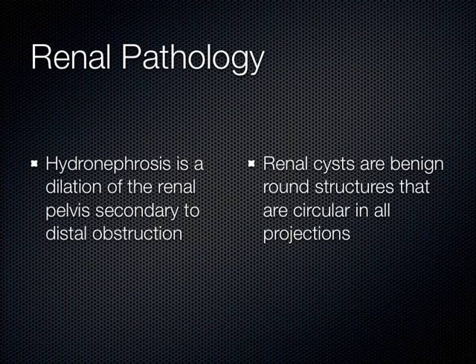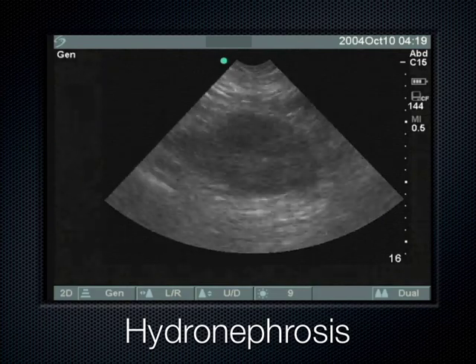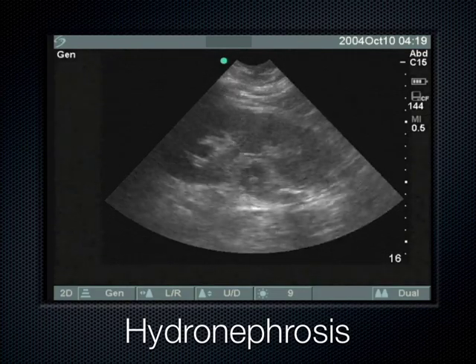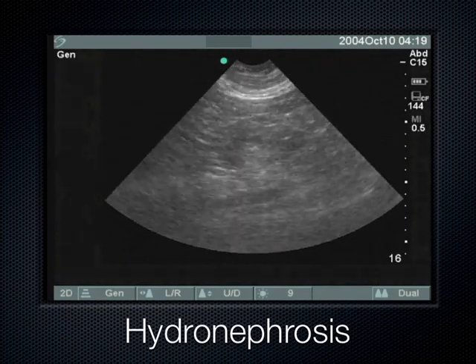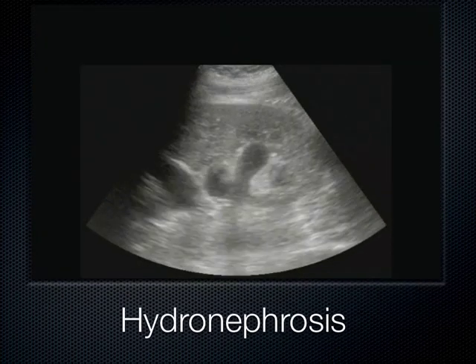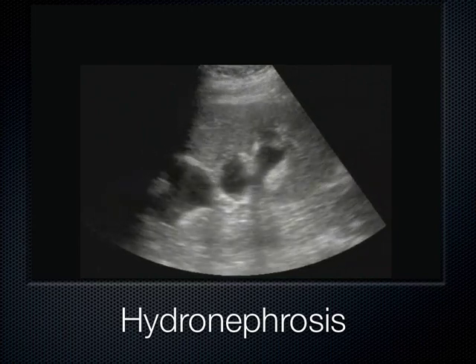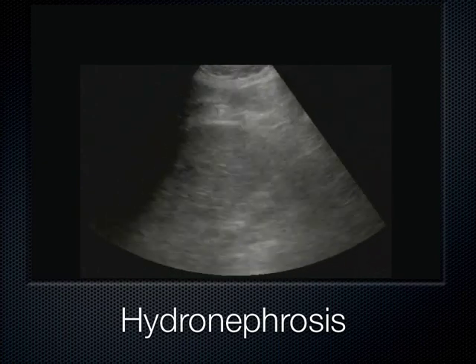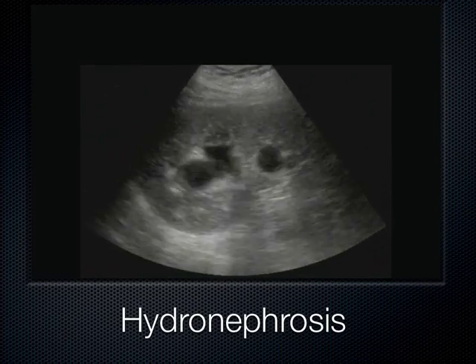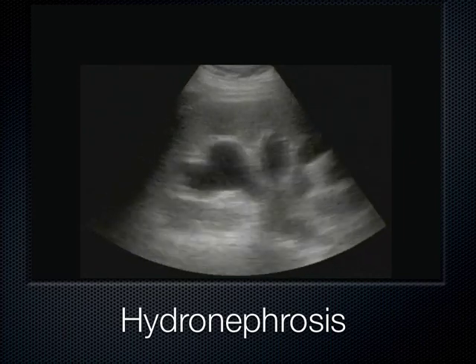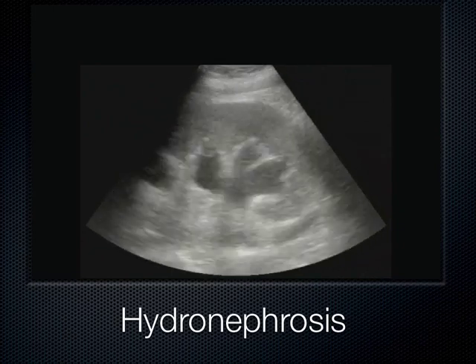If you see anechoic fluid in the center or pelvis of the kidney, that's hydronephrosis — fluid building up in the kidney. Mild hydronephrosis has a glove-like formation with a little bit of splaying in the center; the fingers of the glove go out toward the cortex. As it progresses, those projections become more prominent but still coalesce at the renal sinus. We can still make out plenty of cortex.